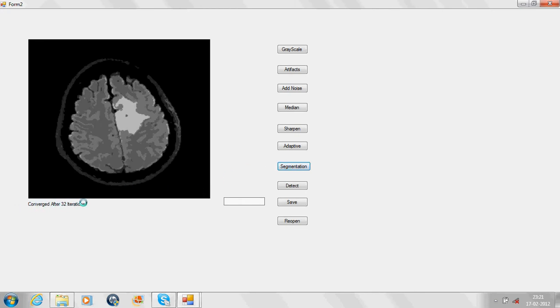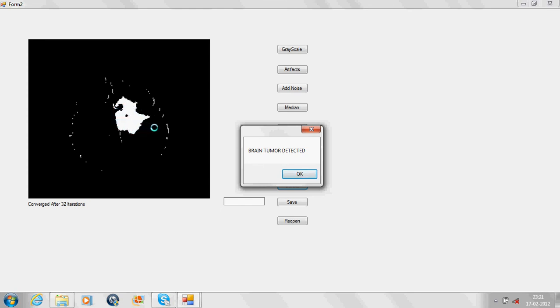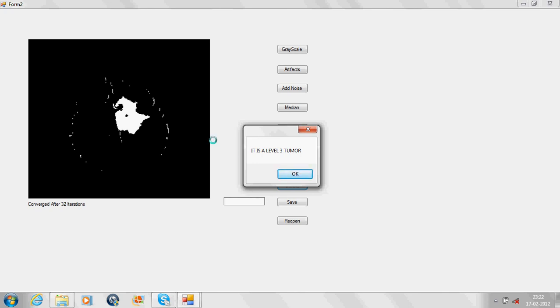After segmentation, the tumor is detected. At the click of the detect tab, the tumor is detected. As you can see, the highlighted part is the tumor. And it is a level 3 tumor. That is, it is a malignant tumor.